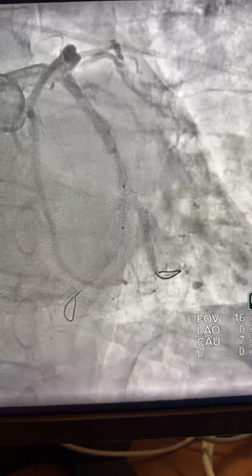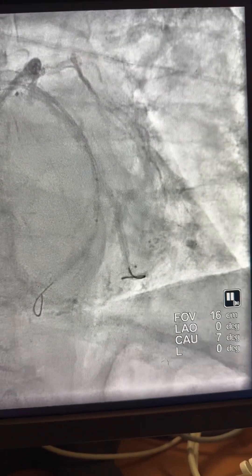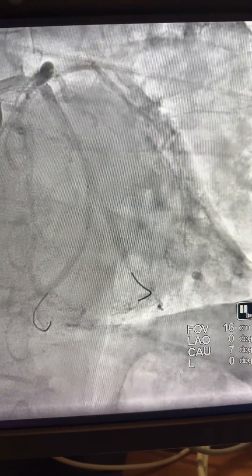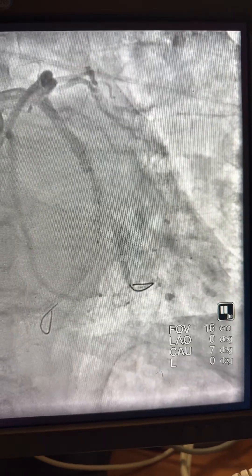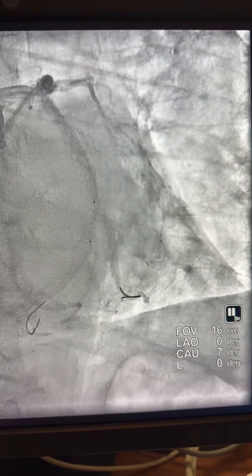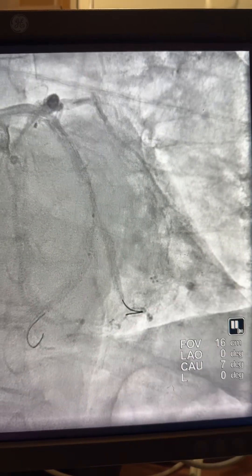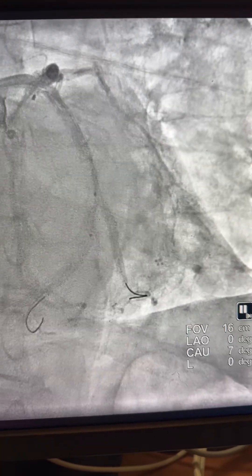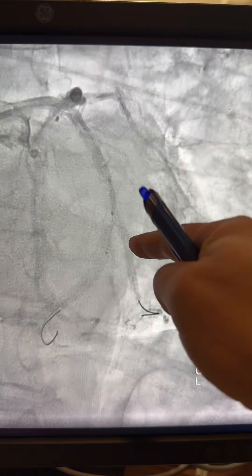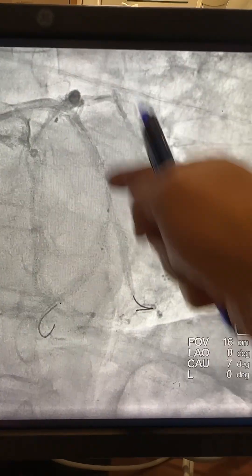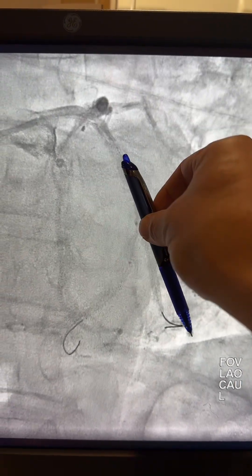Now let's stop here. We can see the bifurcation. The plan was to use a T-technique: a 2.5 stent toward the PDA/PL, and then one 3.5 stent from the circumflex toward the major OM.